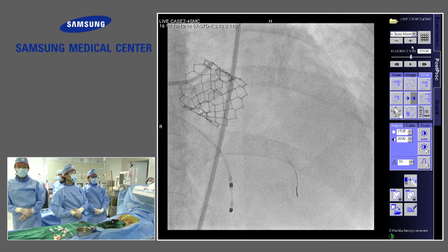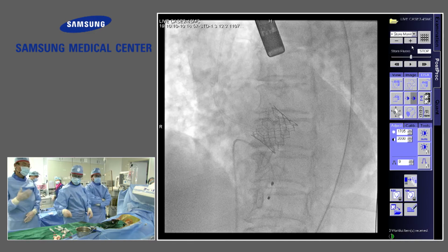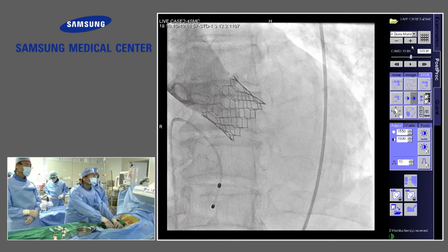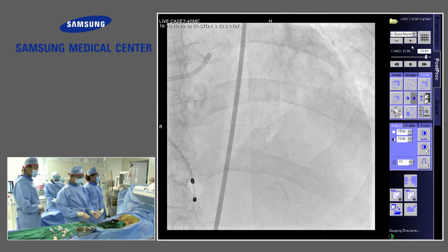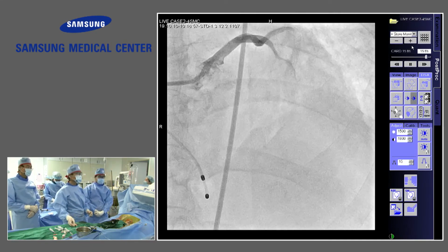The message is that if we have a borderline or a little bit significant FFR before TAVR procedure, you really need the intervention. It will get worse after TAVR procedure. Okay. So this wasn't a borderline lesion to start off with. Message taken. Okay. Next.